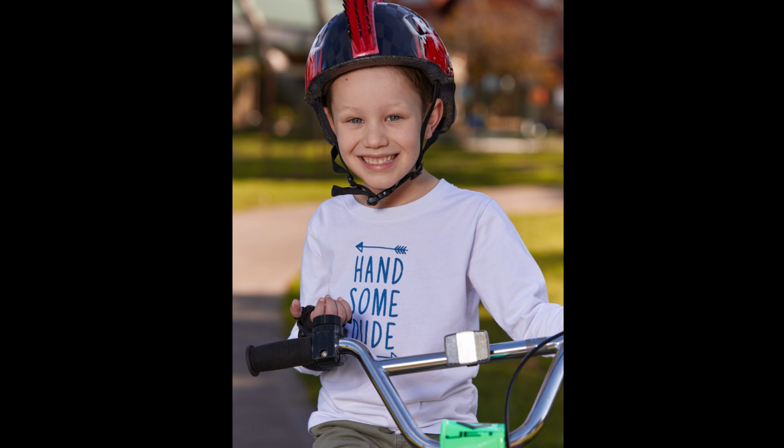And without the family's input, we may have used something really heavy or bulky, which would have been challenging for him physically, but also emotionally. So with the family's input, we were able to get this very well thought through design, and without them, we wouldn't have been able to have all the finer adjustments that led to what you see here.